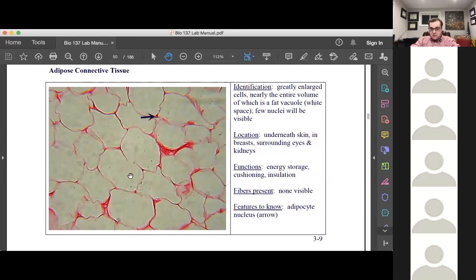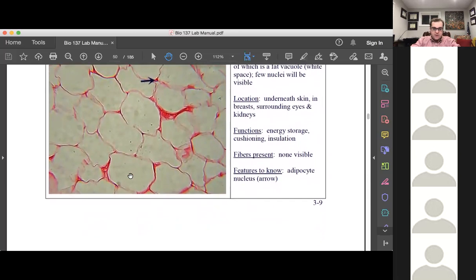To the naked eye, it looks like just a bunch of yellowish mush. We've probably all seen that, where fat is deposited in and around different areas of the body that you have to pick through.